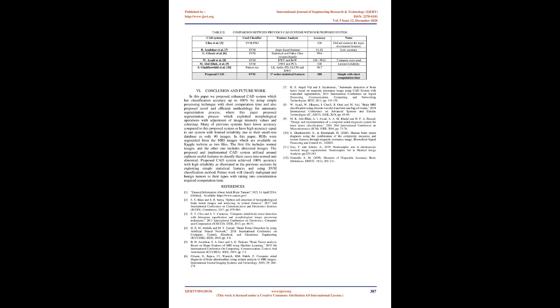6. Conclusion and future work. In this paper we proposed an enhanced CAD system which has classification accuracy up to 100% by using a simple processing technique with short computation time. We also proposed a novel and efficient methodology for the automatic segmentation process, which exploited morphological operations with adjustment of image intensity values and color map. Many previous systems have lower accuracy compared to the proposed system, or have high accuracy equal to ours but with limited reliability due to their small database size, as few as 40 images.